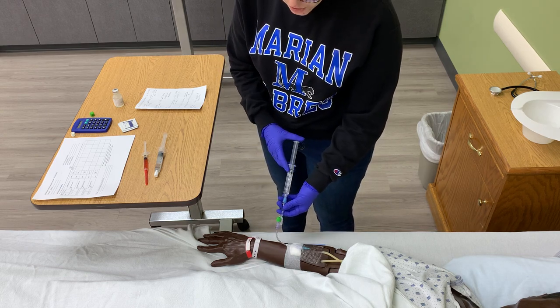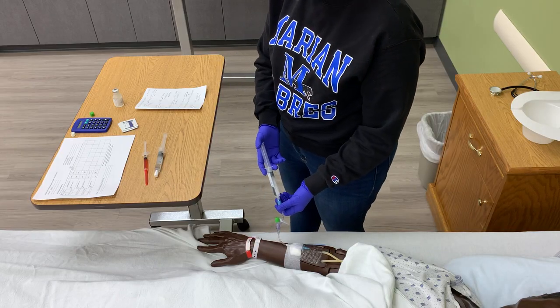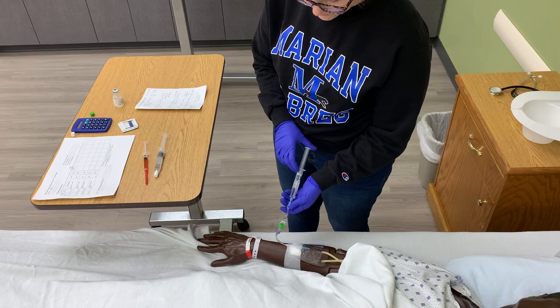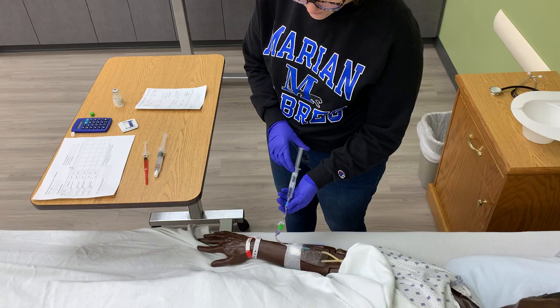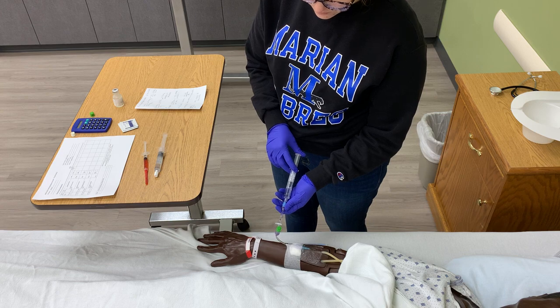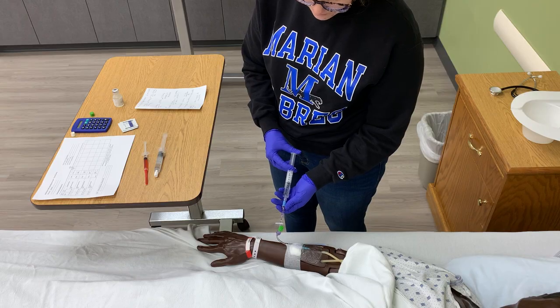So now that I have my blood return, I'm going to check my calculation. I'm giving 1 ml every 6 seconds for this first flush. So I'm pushing 1, okay, another ml. Pushing another ml. Pushing. Another ml in.